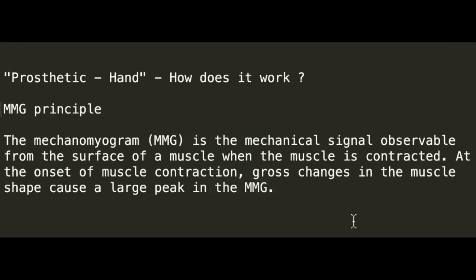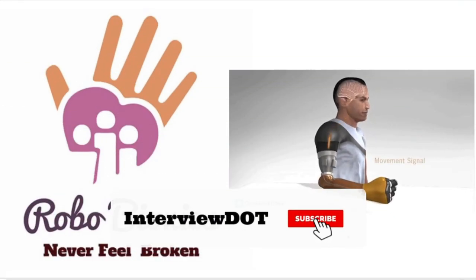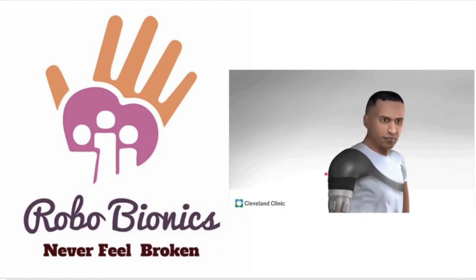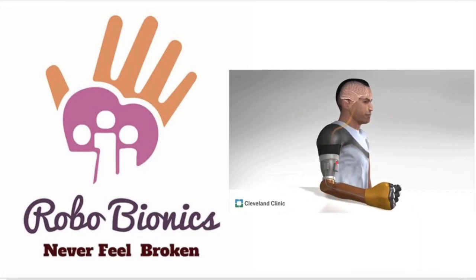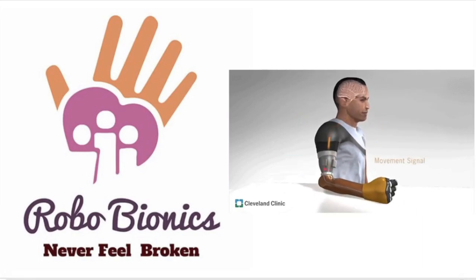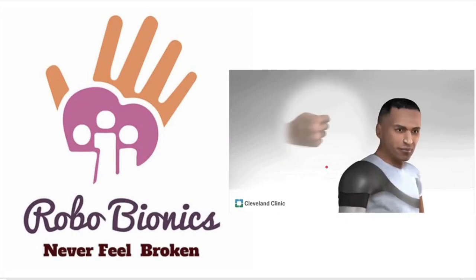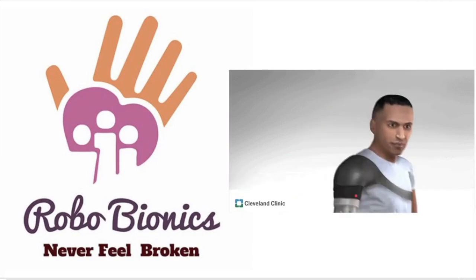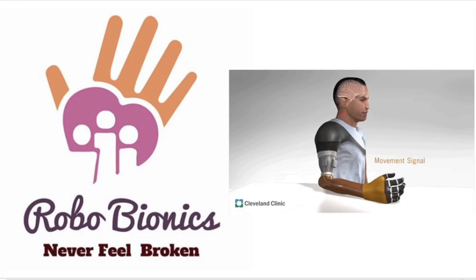Now I'm going to share how it works. It uses a principle called the MMG principle — the Mechanomyogram principle — which uses mechanical signals and converts them into electrical signals. Whenever a person wears this prosthetic hand, there is a sensor attached inside. When the person moves the residual limb, the sensors connected to the prosthetic arm receive signals, and these signals are converted into intuitive hand movement. This is how the muscle movement is converted into an electrical signal and finally into intuitive hand movement.